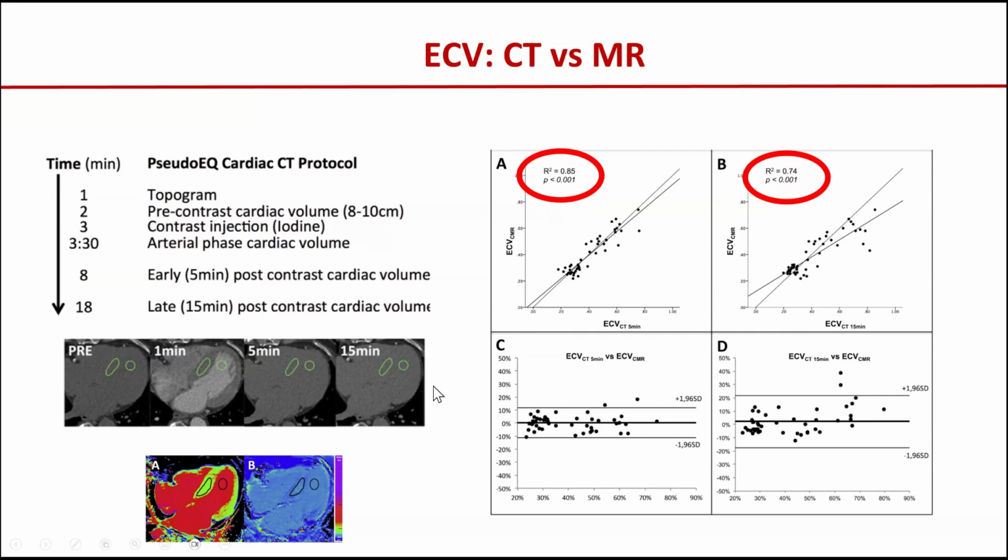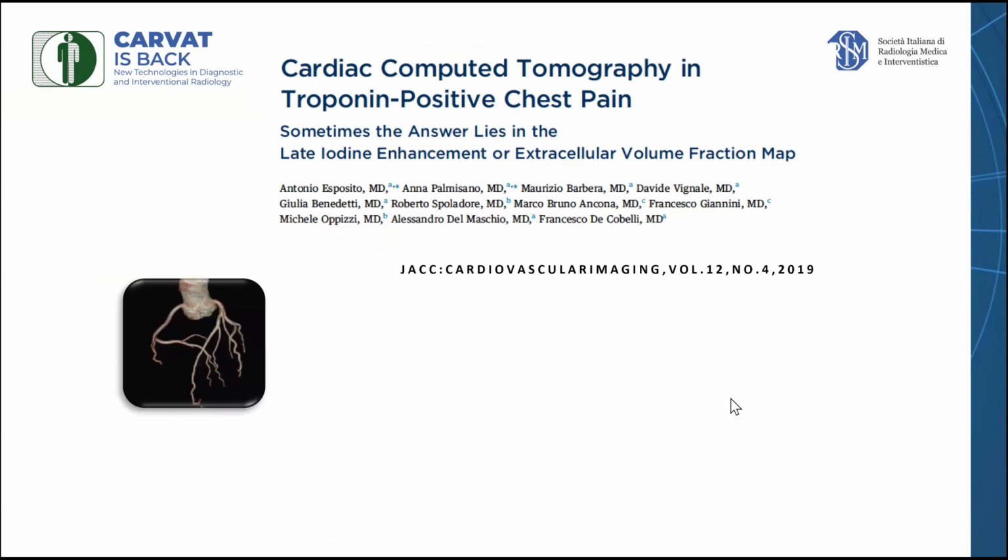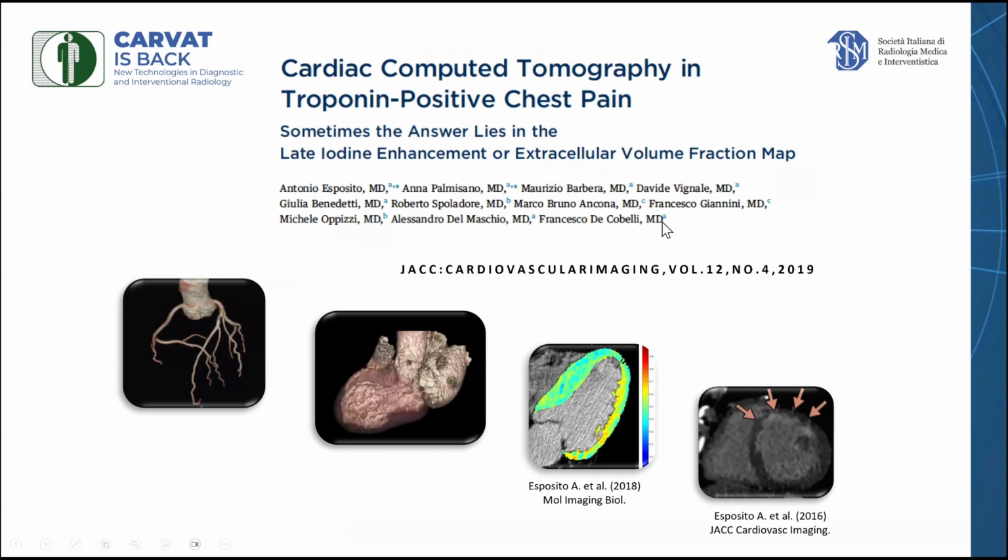Where can we apply the ECV and the LGE in different settings? First of all, we can say that today we can consider CT more similar to CMR. We are evolving from a simple non-invasive angiographic scan of the coronary arteries to a tool that provides an assessment of the function of both ventricles, that provides a good capability to detect focal scars, like these post-ischemic scars in these patients, and also a tool that provides information with the map approach or with a simple ROI approach.